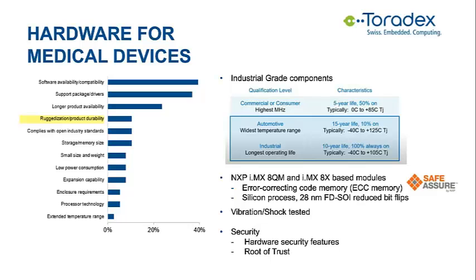I think security is also a very important part in this topic. And here you can check if the hardware comes with any integrated security feature to support the software security features.